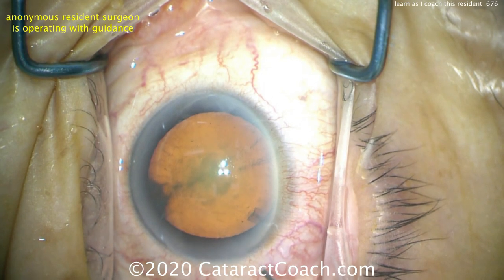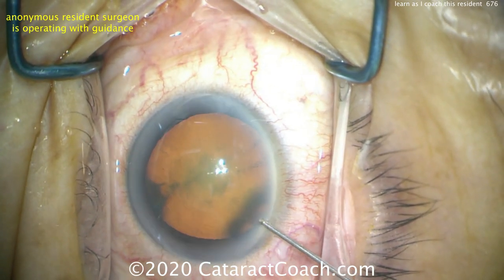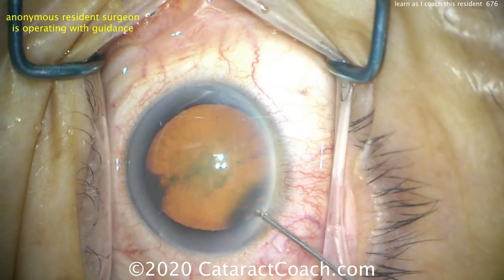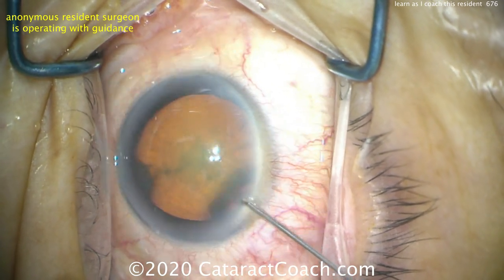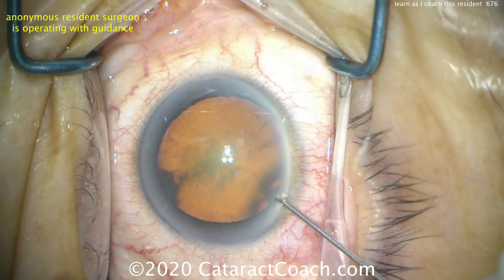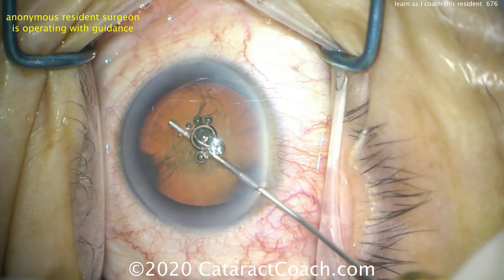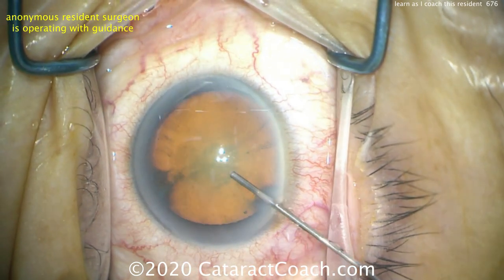So here's the viscoelastic now — disperse the viscoelastic. You did a good job draping the lashes; those are all out of the way. Good exposure, good anesthesia, this patient's in a good position. Now to get that cannula in the eye, you have to go in the exact same plane that you made the para. There you go — come across the eye now. Good, and inject a wave of viscoelastic. Perfect.